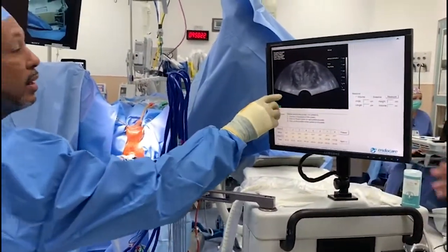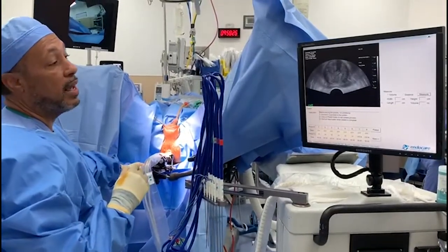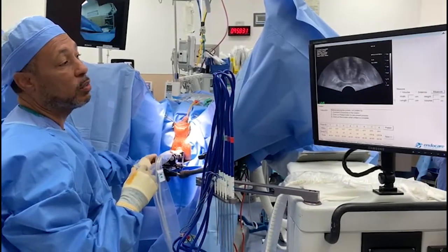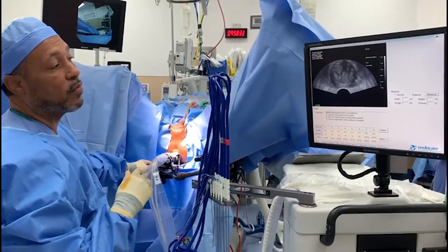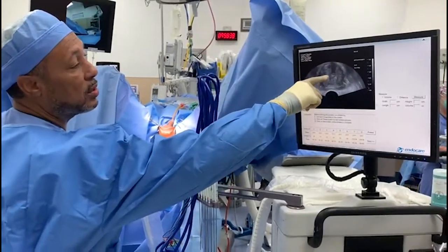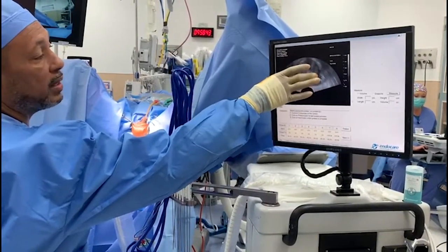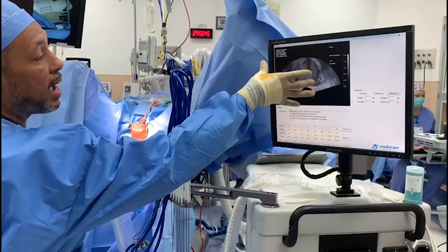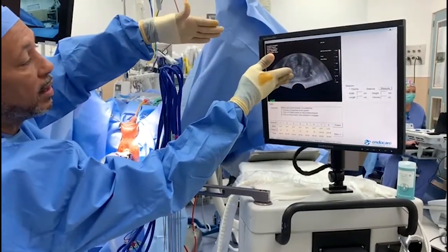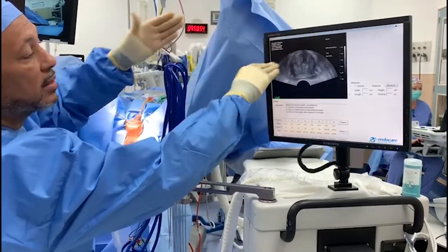On the ultrasonic image, I'm at 70 here on the stepper and I should be right near the bladder. Here are some of the vesicles and we're in the bladder — only three or four clicks out from the bladder itself. The midline shows the urethra in line and everything is lined up in the horizontal plane. Because if you're cockeyed and it's off to the side, your probes are going to be going in at a very unnatural angle. We want the horizon nice and flat.